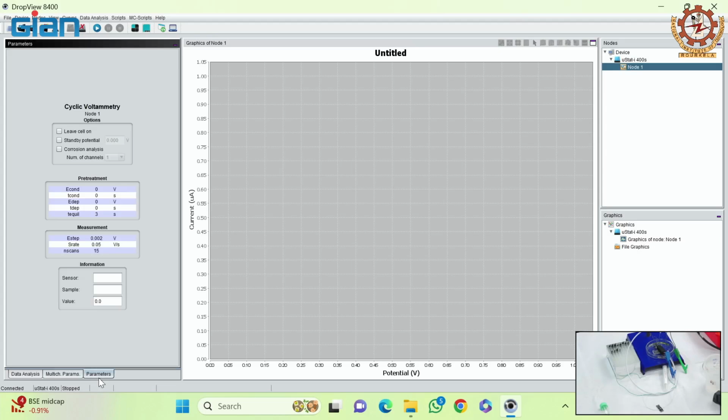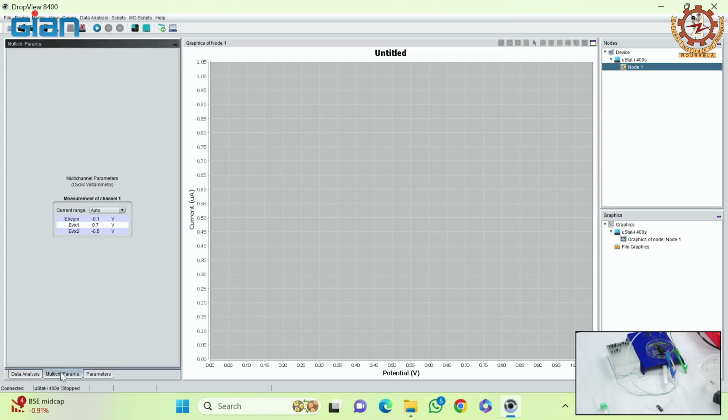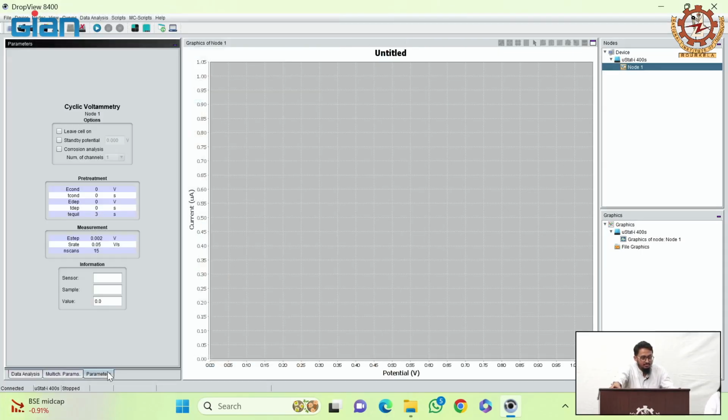Ready? Parameters are set, E step, E begin and all that. E begin is at minus 0.1, EVTX1 is 0.7 and EVTX2 is minus 0.5. So we are going to start the CV scan. Please start the scan. Ready? Please start the scan.